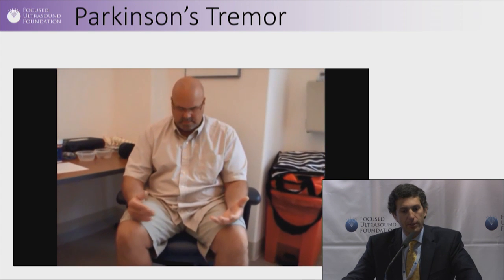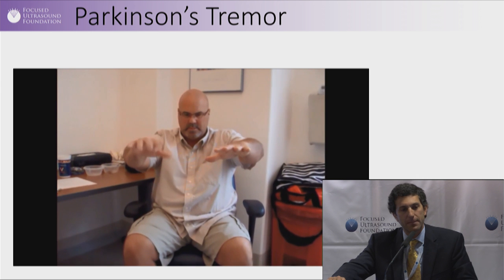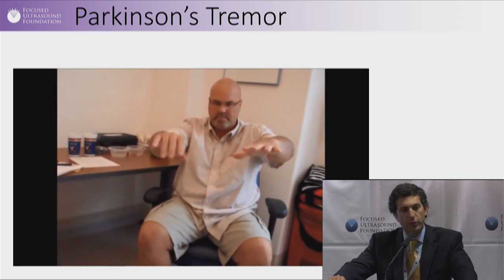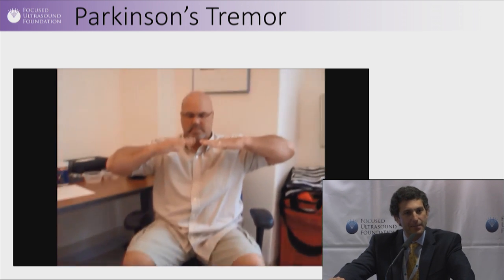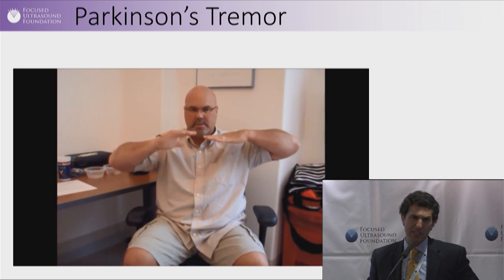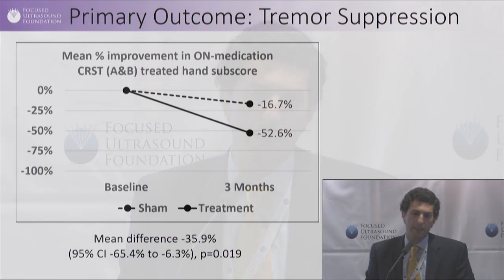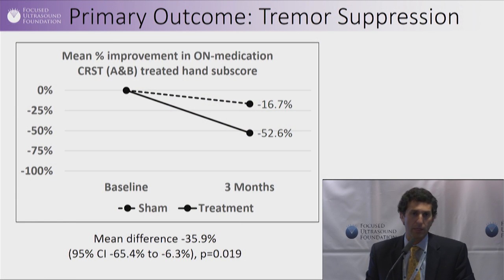This is Parkinson's tremor. This particular subtype of Parkinson's disease, or this flavor of symptoms, is very similar to essential tremor. I think it's kind of a natural next step after the studies in essential tremor. These patients often have some of the same limitations or disabilities that you could get with severe essential tremor. And so we have just completed a clinical trial in 27 patients with Parkinson's tremor. These are tremors that are severe. They're refractory to all of the latest medical therapies.